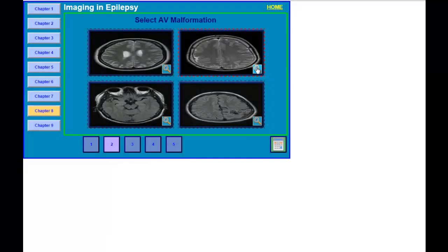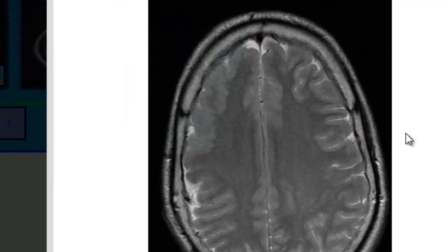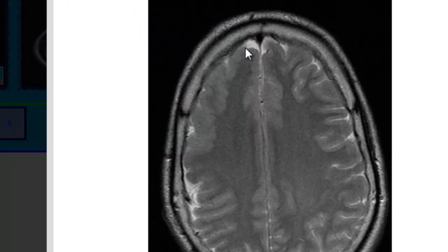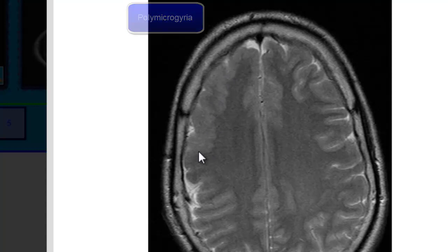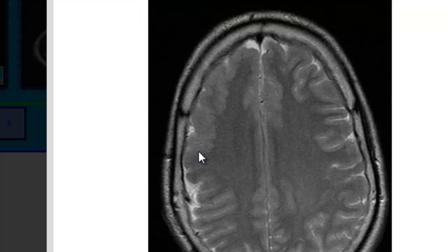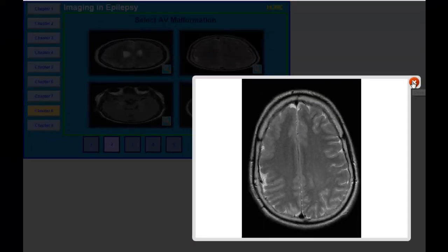Comparing the gyri on the left side and the right side, the right side appears different. This is what we call polymicrogyria on the right side, with some area of dysplasia. This dysplasia and polymicrogyria can be a presentation in patients with seizures.